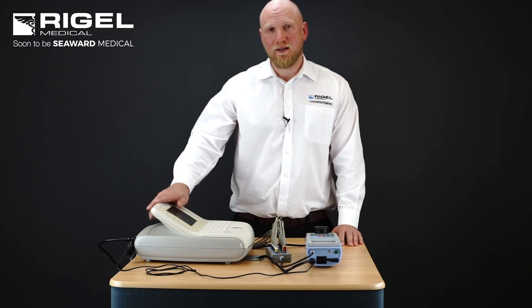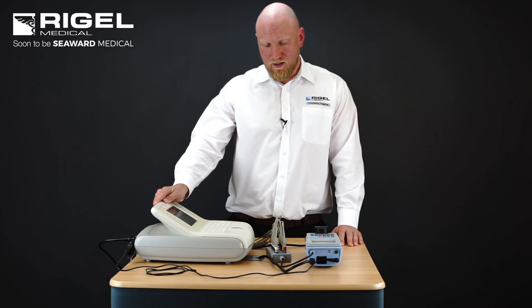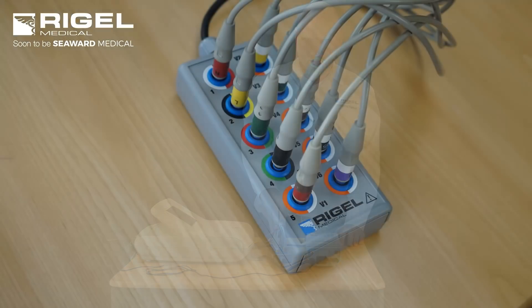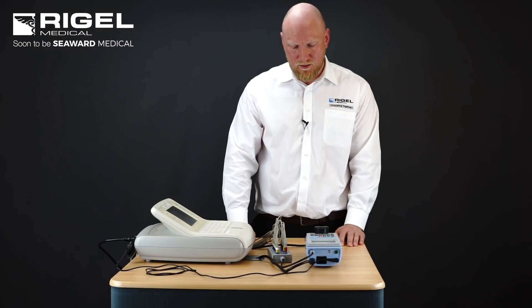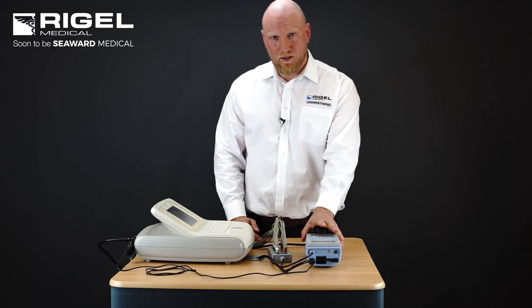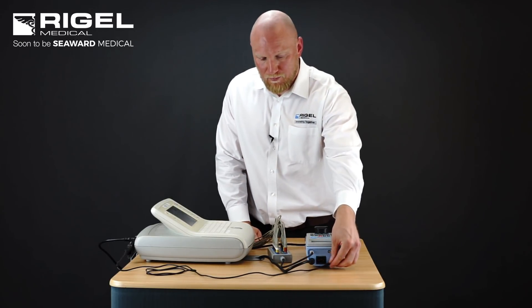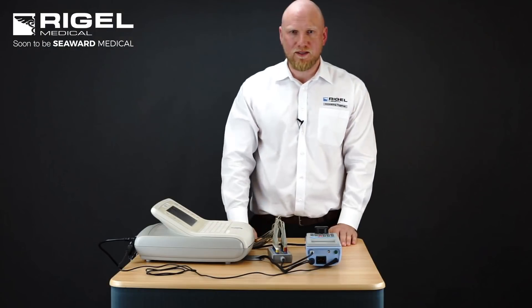Under test today is this ECG monitor — a 12-lead ECG monitor with 10 applied parts. The applied parts are connected to the applied part adapter box which is attached to our 288 Plus. The equipment under test is plugged into our device under test socket, the 288 Plus is powered by mains, and we have the earth bond attached to the earth reference point of the ECG monitor.